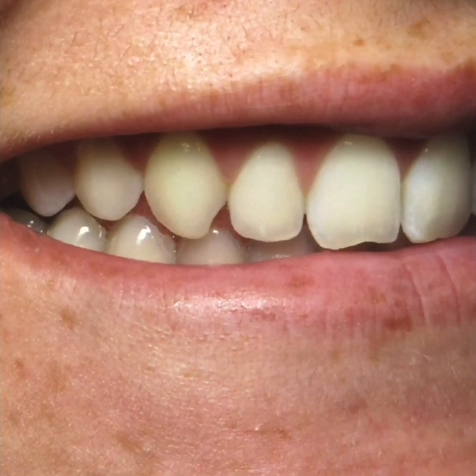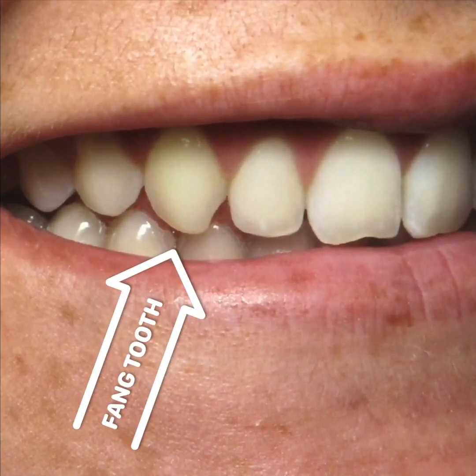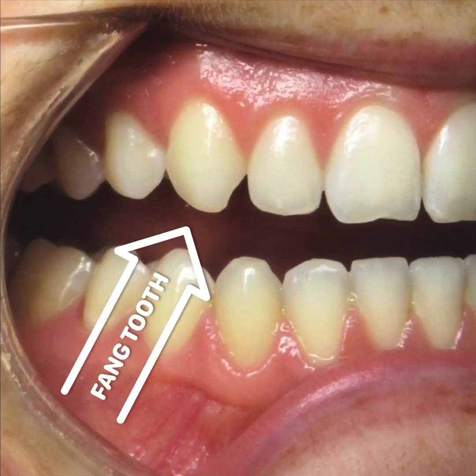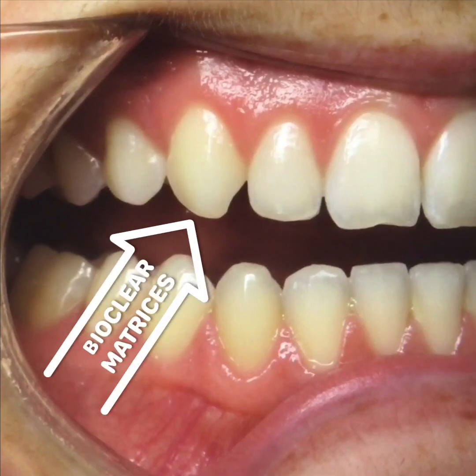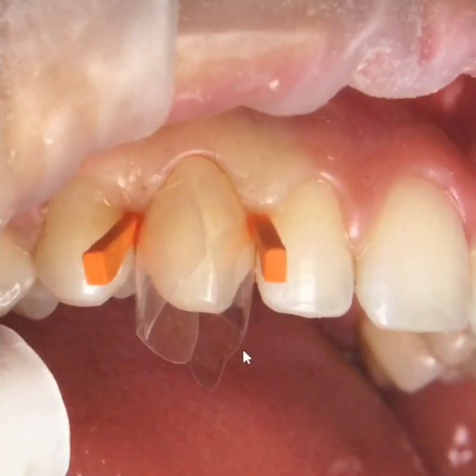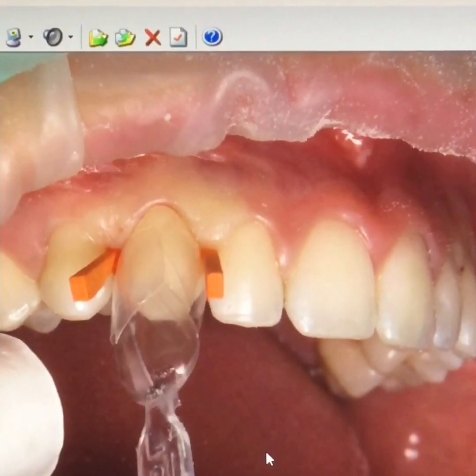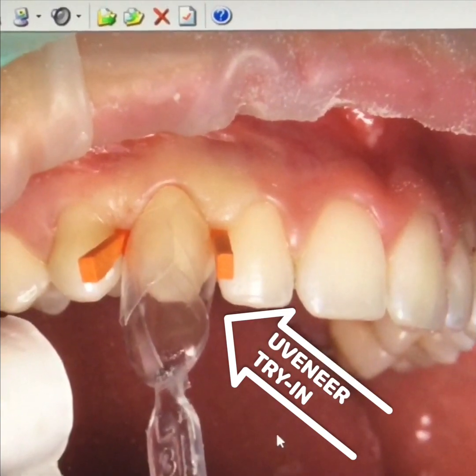This young patient didn't like her eyetooth because it looked like a fang. So we recommended the Bioclear Uveneer process, and this is how it works. We put a Bioclear matrix around the tooth, wedge it, and then we use those matrices like an aquarium around the tooth, and then place a U-veneer over the top to make it look like a veneer.